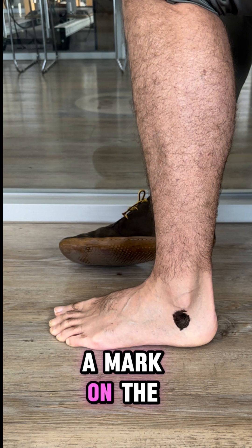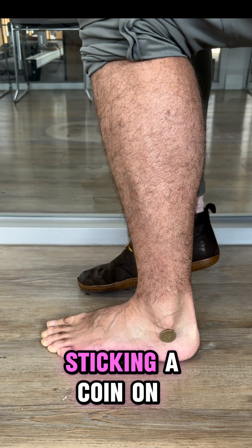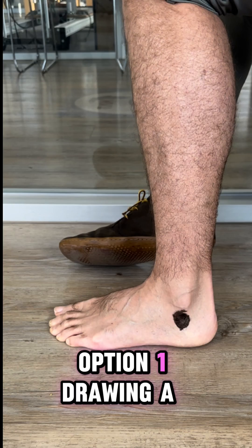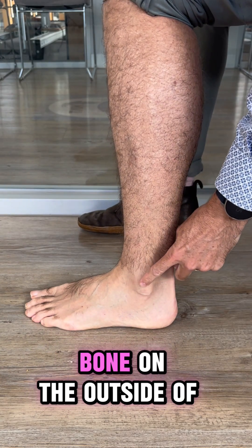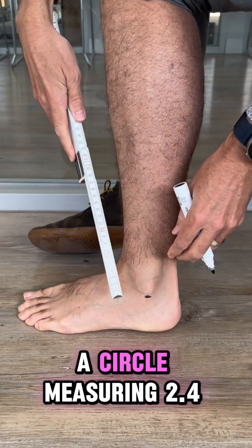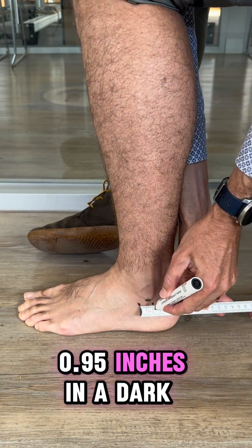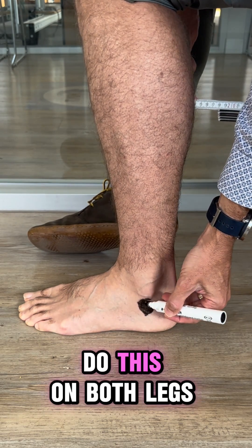Now it's time to place a marker on the outside of your heel. You have two options: either drawing a circle or sticking a coin on with tape. Option one is drawing a circle. Find the most prominent bone on the outside of your ankle and follow this bump down. Under this bump, draw a circle measuring 2.4cm in a dark marker. Do this on both legs.